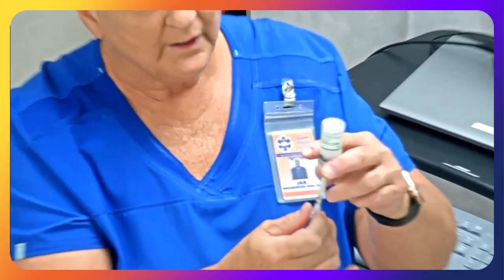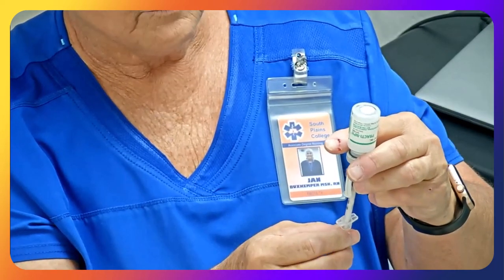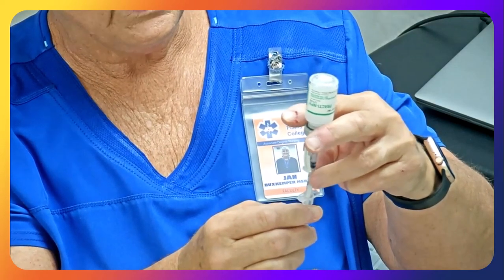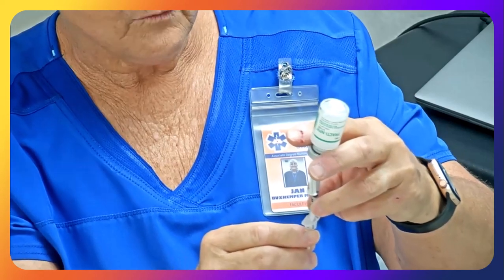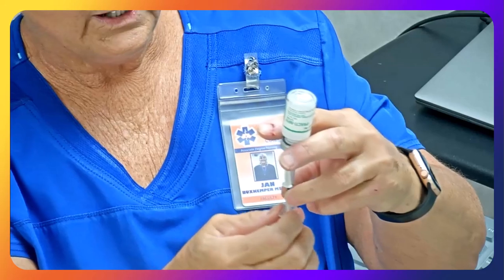And I need to very carefully, I cannot overdraw. I need to pull back my 12 units, so that would give me a total of 20. Because I have 8 of regular and 12. Okay, so there is 20.